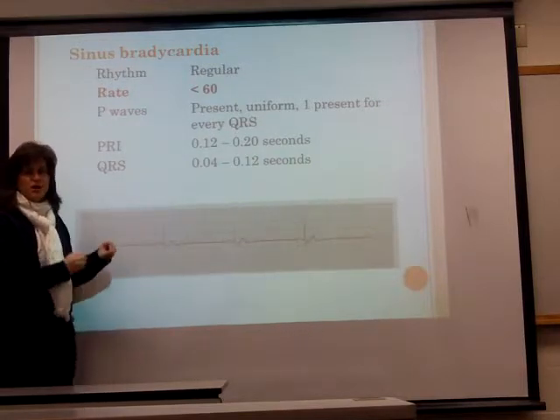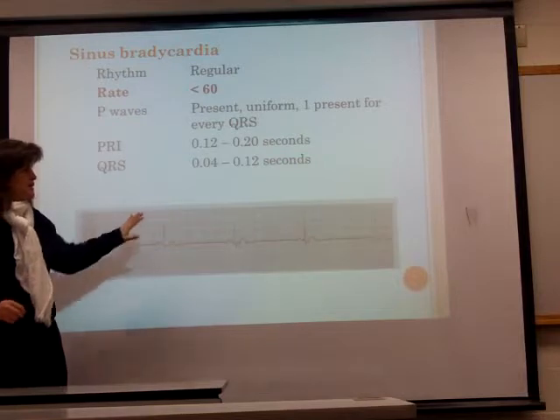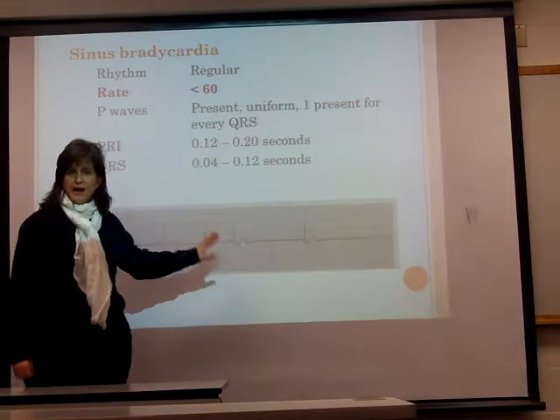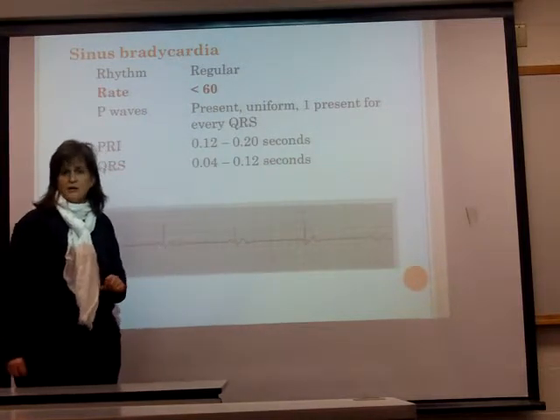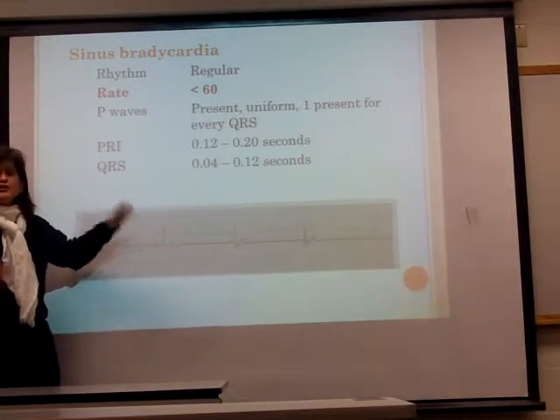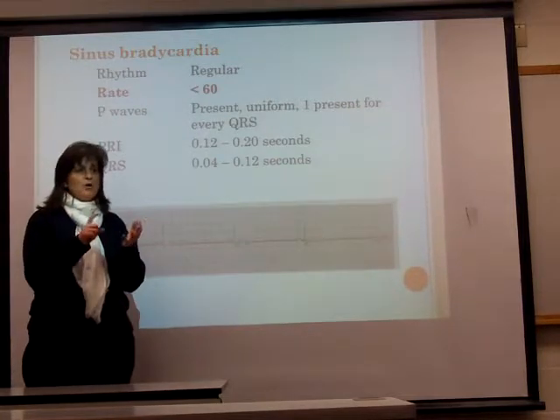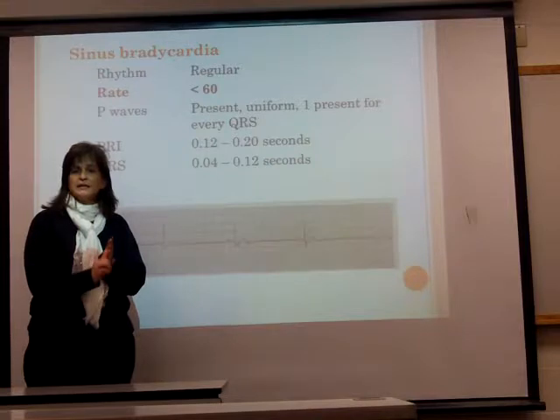With sinus bradycardia, as you all have learned since your first semester of nursing school, if a patient is symptomatic with bradycardia, then we're going to have to treat it. If they're asymptomatic, most likely we're not going to treat it. So when it comes to answering this on the exam, for the treatment, you have to give me 2 separate entities. With symptoms or symptomatic, however you want to word it, you would give atropine and continue to monitor.